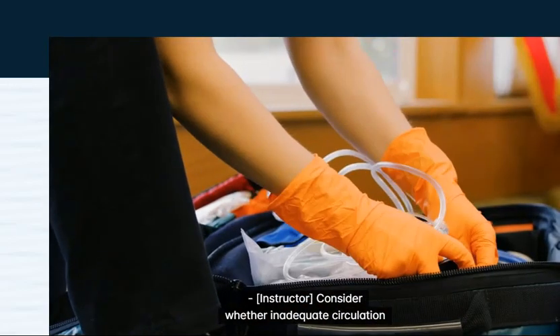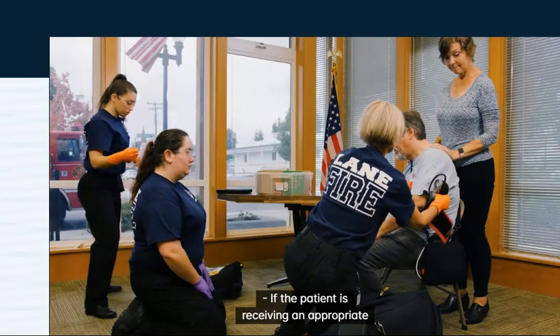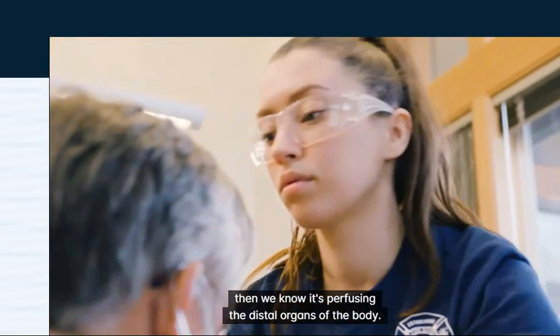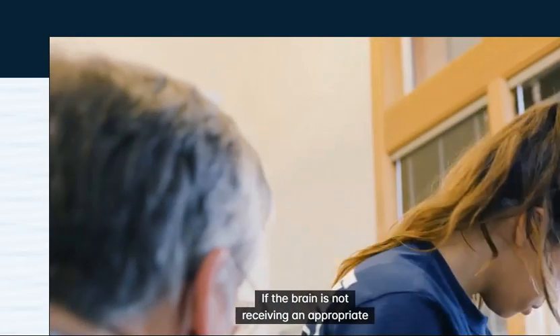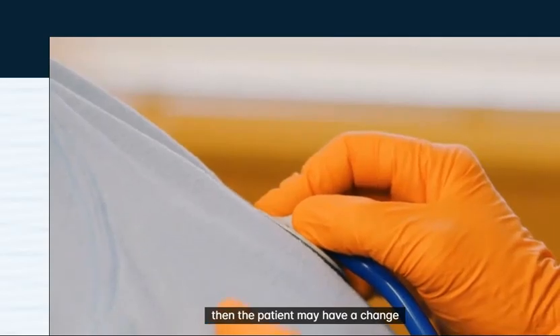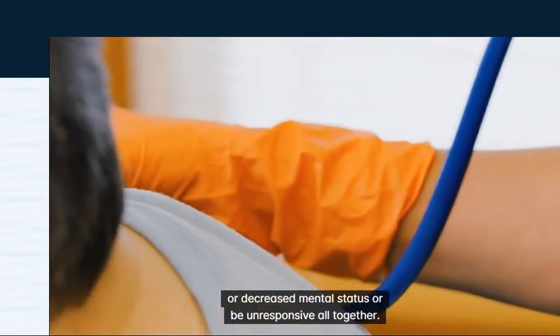Consider whether inadequate circulation may be affecting the patient's level of consciousness. If the patient is receiving an appropriate continuous mean arterial pressure, then we know it's perfusing the distal organs of the body. One of those organs is obviously the brain. If the brain is not receiving an appropriate mean arterial pressure, or MAP, then the patient may have a change or decreased mental status or be unresponsive altogether.